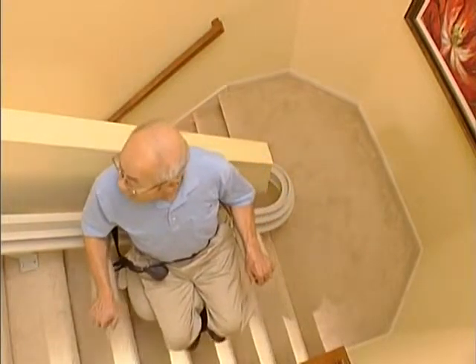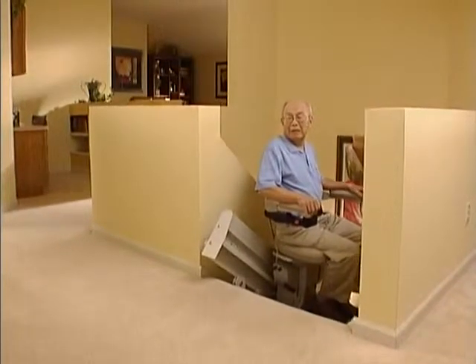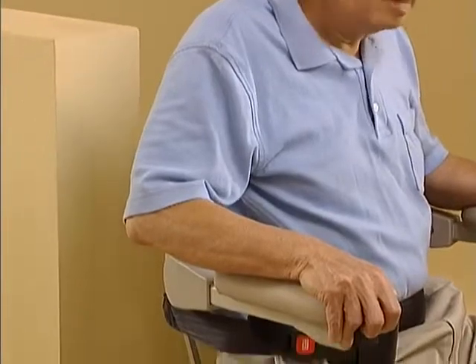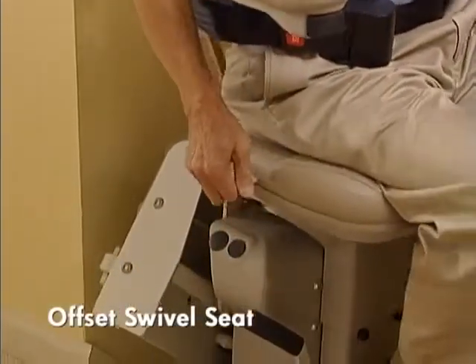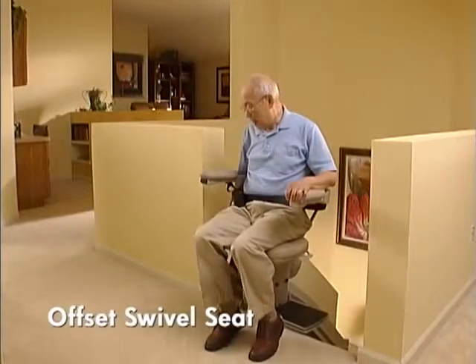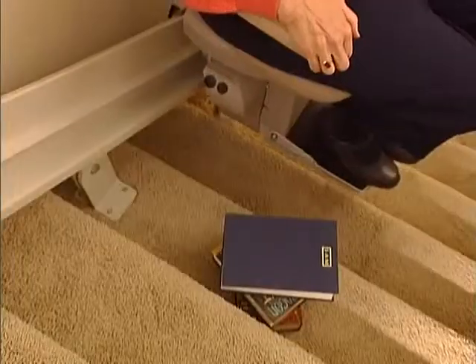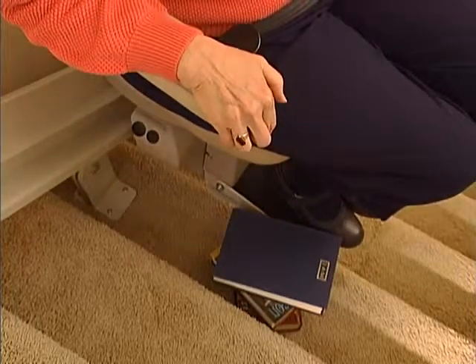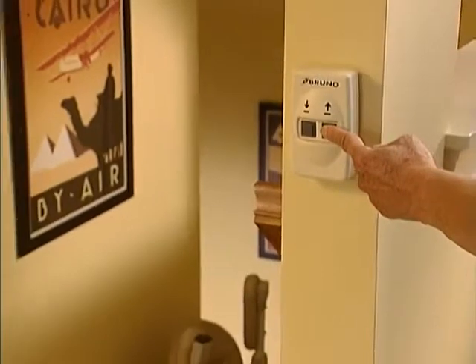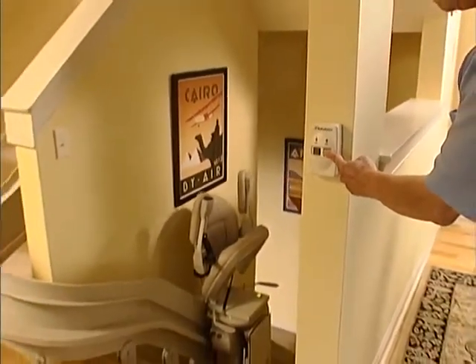Great products are often judged by the features that are standard within their design. This custom curved rail stair lift meets the test. Here are just a few: A new offset swivel seat makes the entry and exit position at the top of the stairs safer and easier than ever. The footrest and carriage safety sensors stop the unit even if the smallest obstacle is in the way. Two wireless call-send controls make installation simple and clean, with no wires running along the wall.